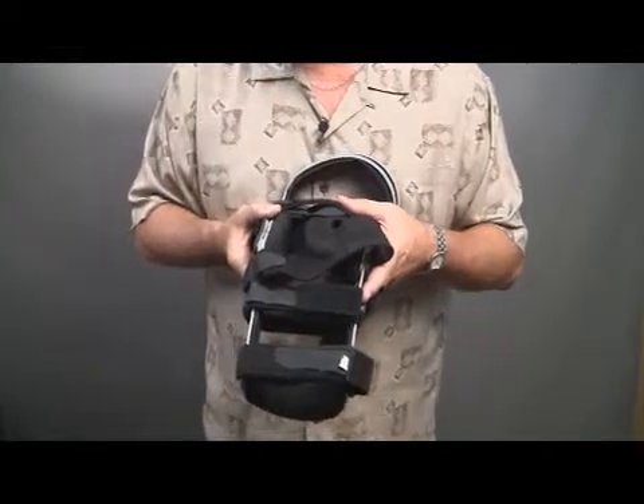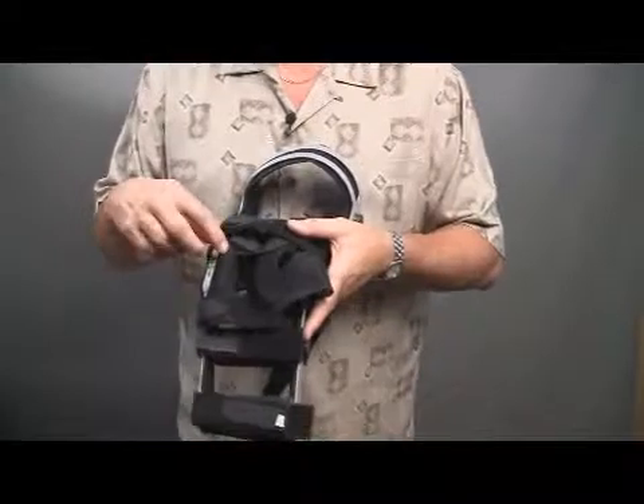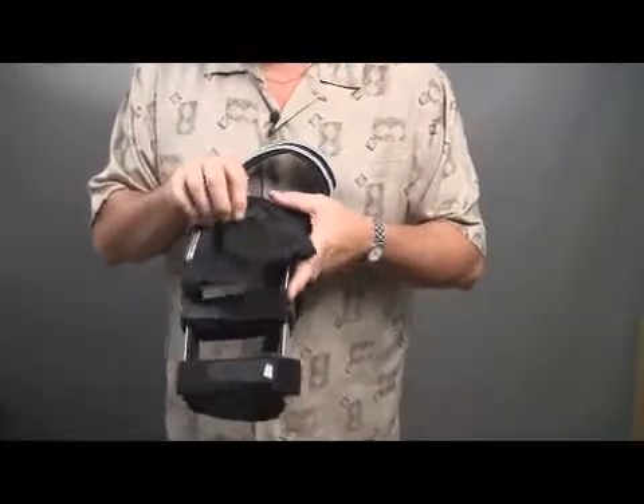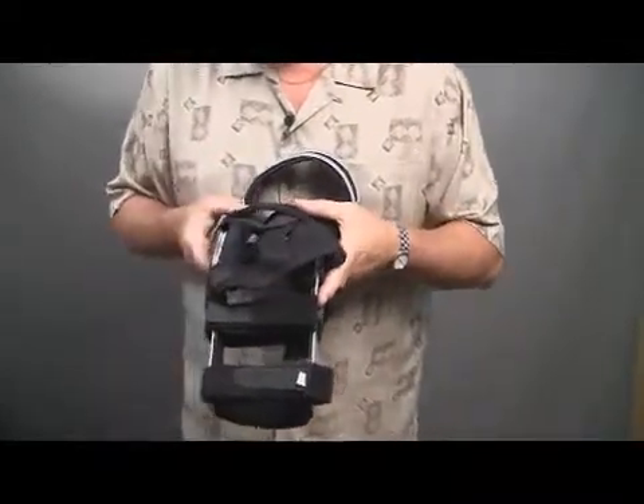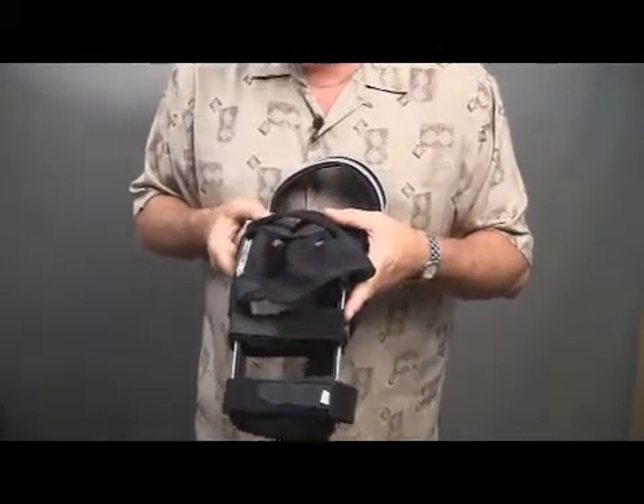This product is an add-on under L code L2795 for your off-the-shelf braces, and for custom braces it's L2800. It is a patella strapping stabilization unit for functional knee bracing.